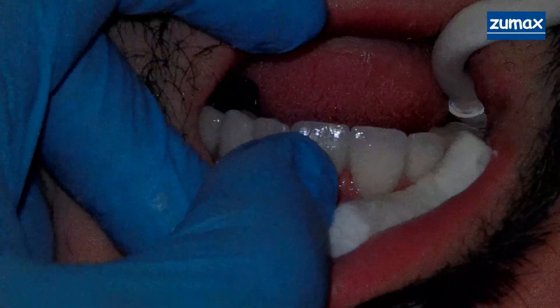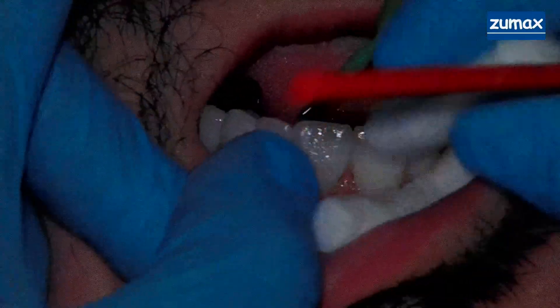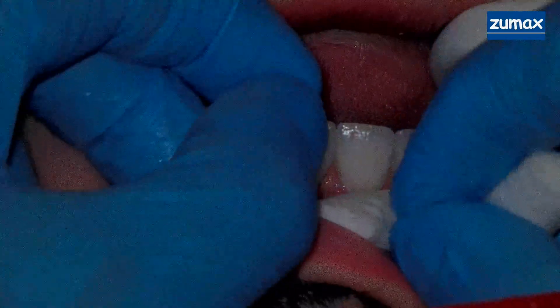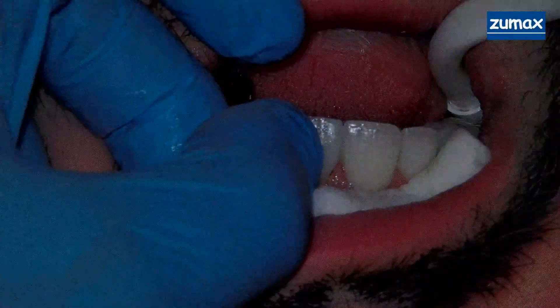Clean, clean, clean. Give me my cotton roll. Make sure there's no excess on the facial — it's nice and clean. Push it into position and go ahead and cure that.